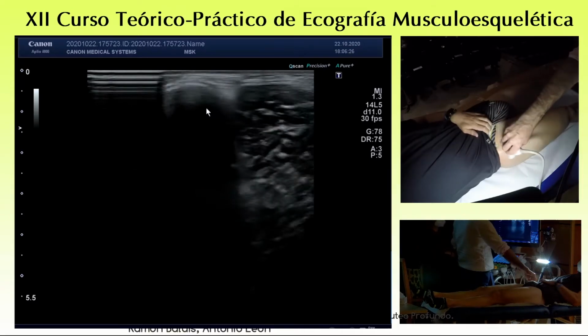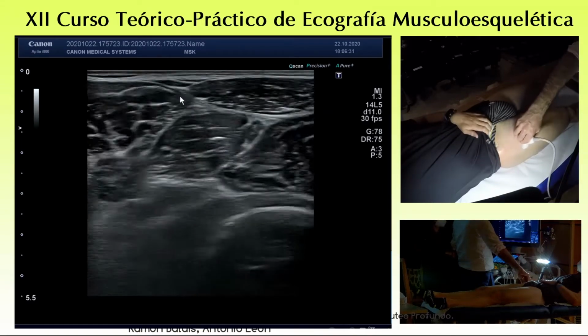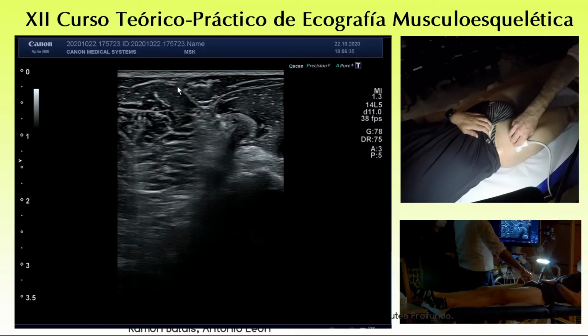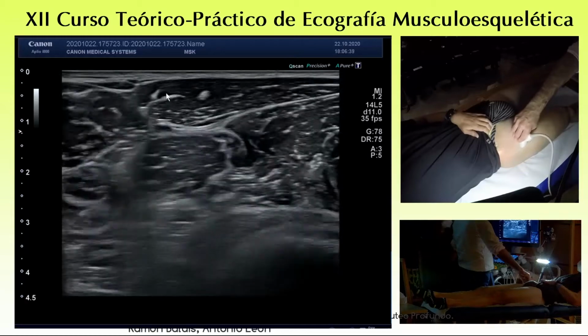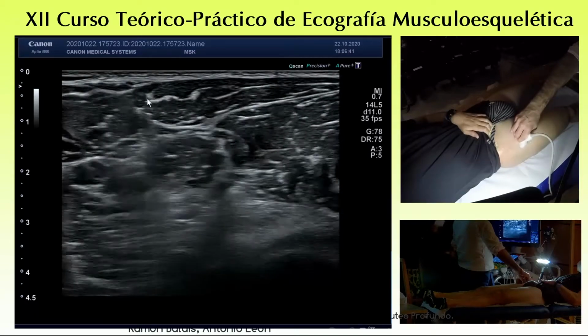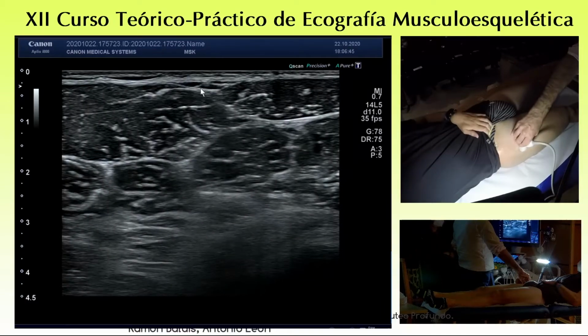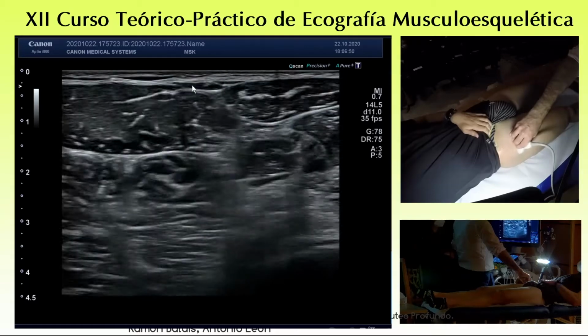distal. So, as I suggested before, the best thing is first of all to adjust the image, and to look for the sartorius, and in particular for this triangle of fat tissue just in between the tensor fasciae latae and sartorius.